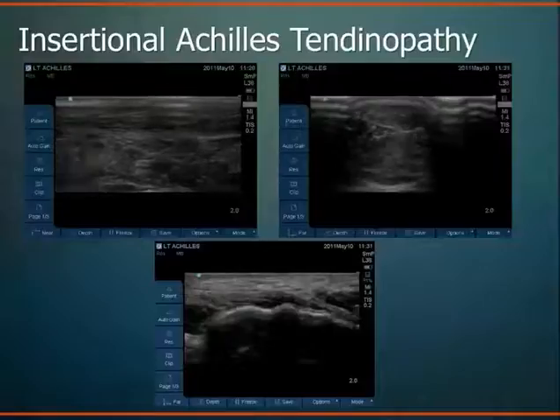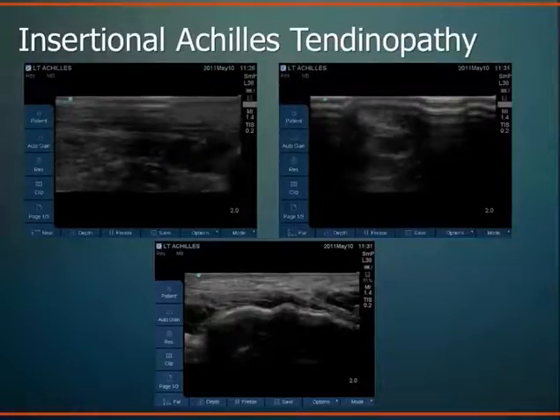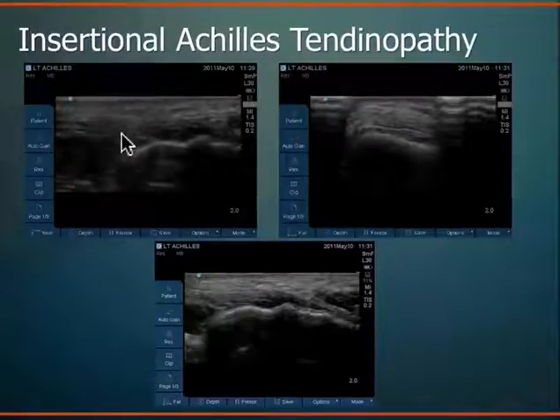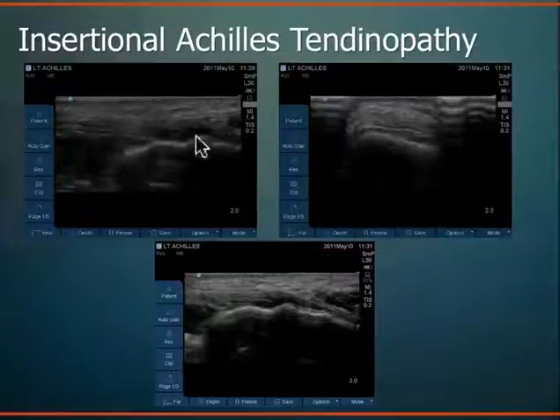There's a patient I saw on Tuesday, comes in with 6 months of Achilles pain, heel pain, a runner, and is basically at wit's end because he can't get back to his training, lots of pain. And what we're showing here is basically the distal Achilles tendon coming down to the calcaneal insertion here. So the earlier movie was just basically showing the continuity of the tendon, very healthy tendon. This is the short axis view of the tendon here, calcaneus, hyperechoic line here.